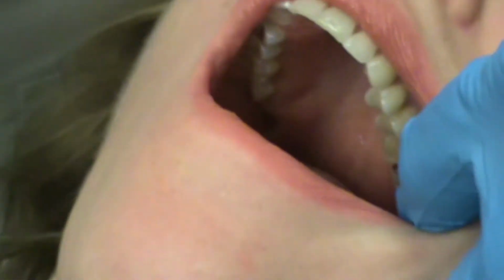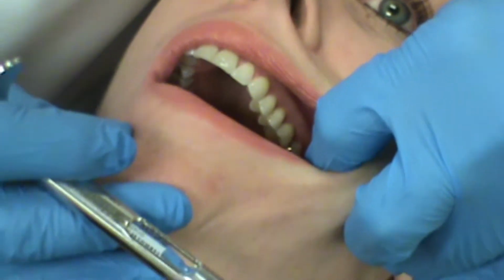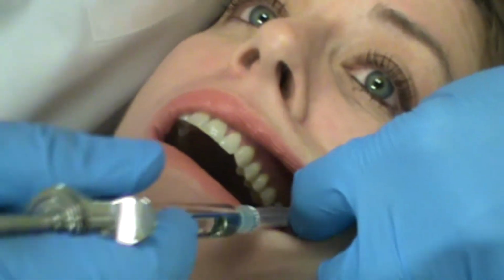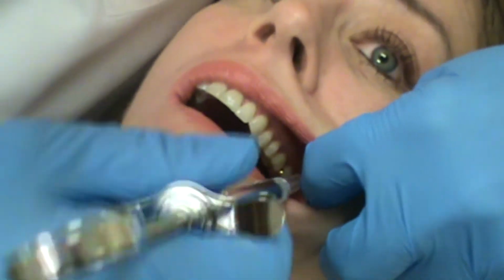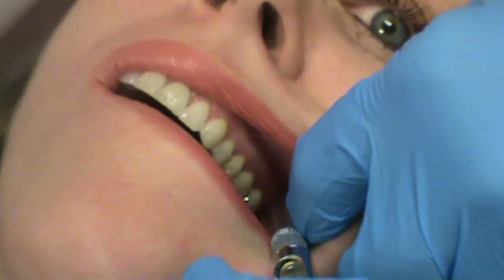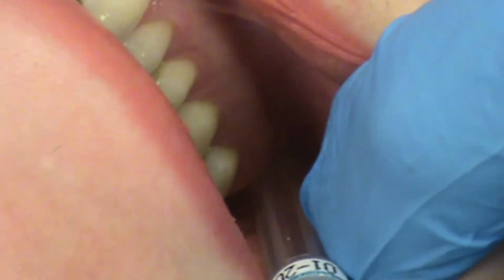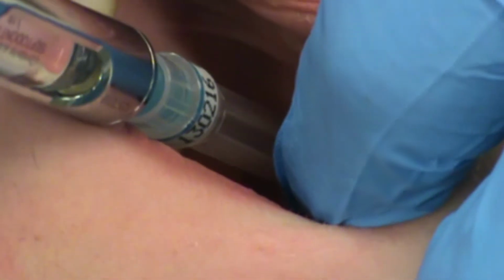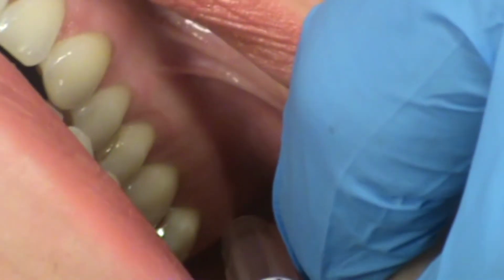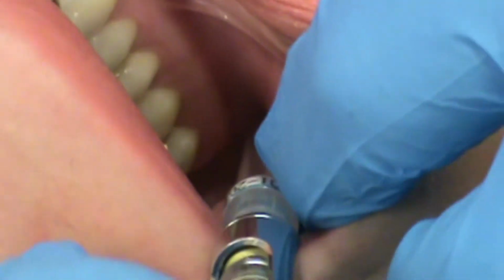So then on the upper arch, what we'd want to do is have her close a little and slide her jaw to the left if possible, so that when we're doing the posterior superior alveolar injection, we can slide around behind. See, I'm really going way behind and above that terminal molar. I'm not going straight up here. I'm turning the corner and going behind the bone and depositing it right there. Can you see that okay?